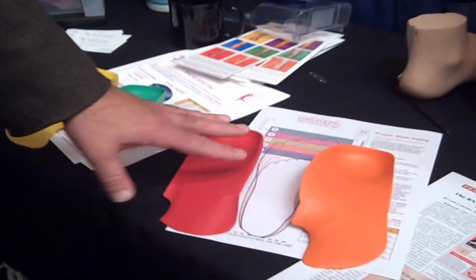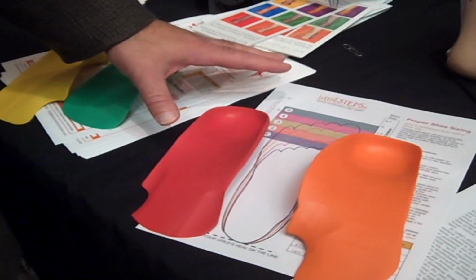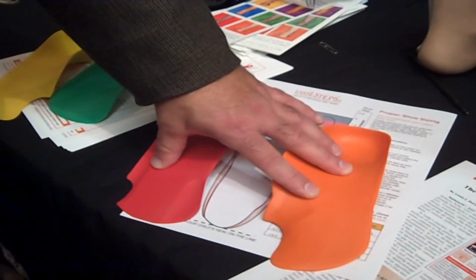I can modify them just like a custom orthotic. I can grind them, I can change the heights of the heel cup. I can add my own covers to them. I can add a heel lift to one. They're completely customizable. The only thing I cannot do is I cannot put them back in the oven and reheat them because they are made of a rubber.